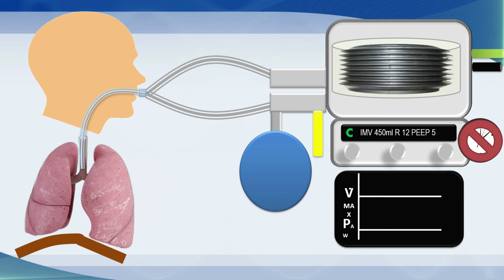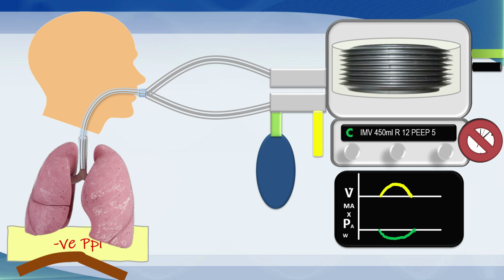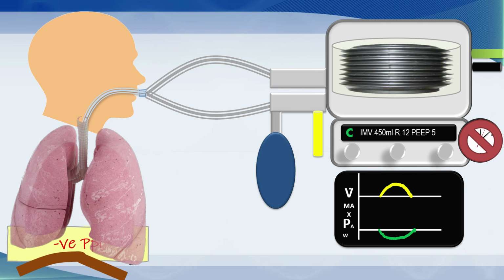drawn principally from the expiratory limb of the circuit. Even if there's a few liters of flow being dialed up in the inspiratory limb, that's just not enough to meet peak flow demands on this very rudimentary ventilator. So the patient will draw breath from the bag on the expiratory limb. So the patient takes a breath and they draw their breath from that bag.